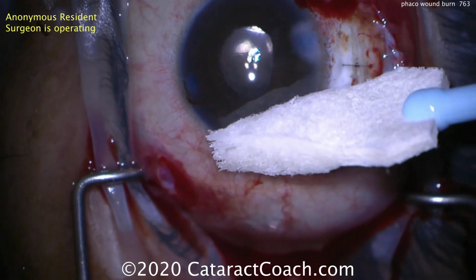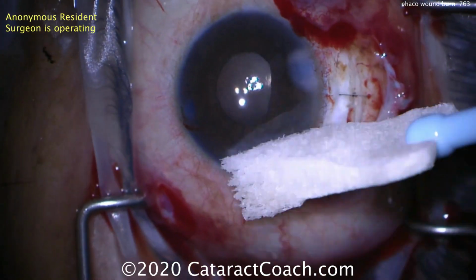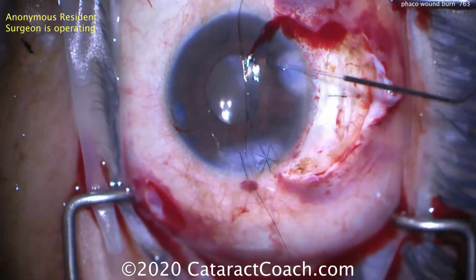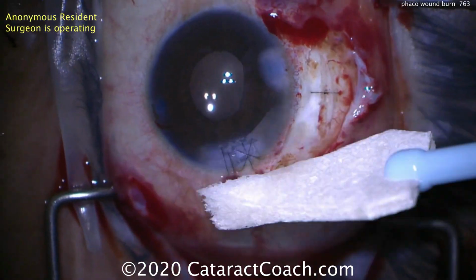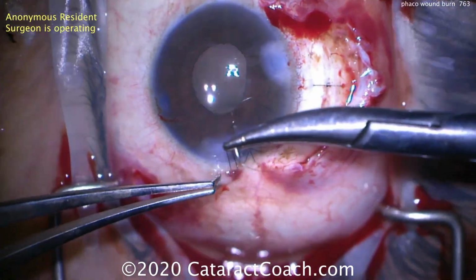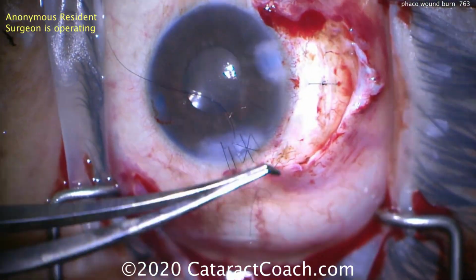You can't. And so in this case, the resident had to do suture after suture after suture. And look, there's still a leak there. Another suture being placed. So at the end, it required so many sutures for closure. This will also induce significant astigmatism, which will hopefully fade with time. And this patient is very fortunate because the result in the vision was actually pretty reasonable.